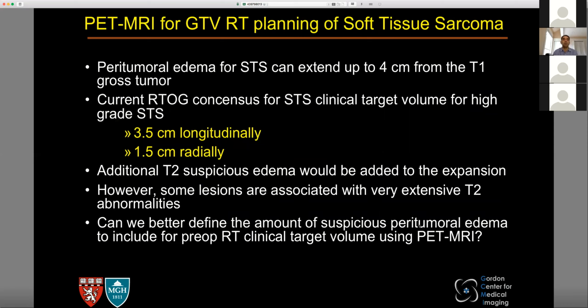All right, so the second example I'm going to show you is, again, where we're going to be guiding radiation therapy. But here what we're going to look at is, can we have a better contour of where we treat? And can we tell if a lesion has responded or not? Those are things we cannot do necessarily with MR alone or with CT alone, but with PET-MR we can. So let me show you an example.